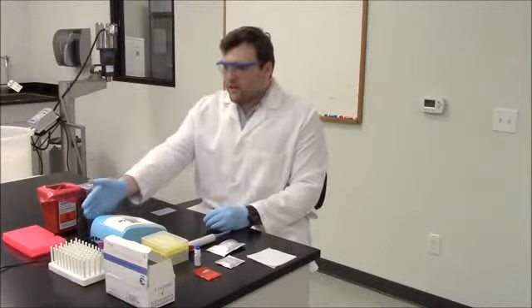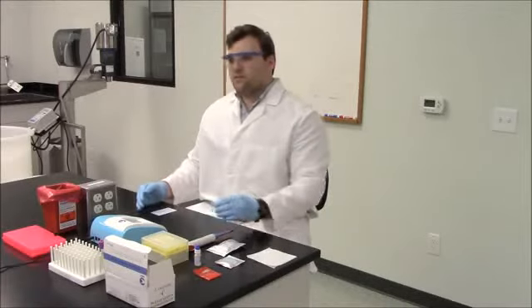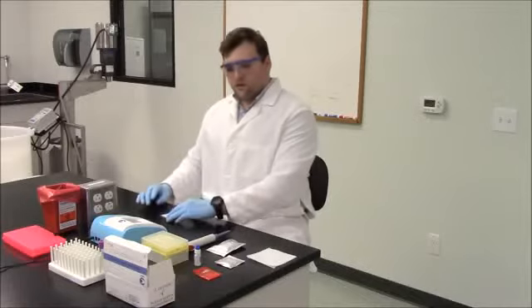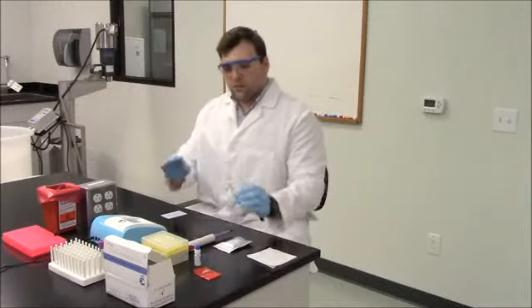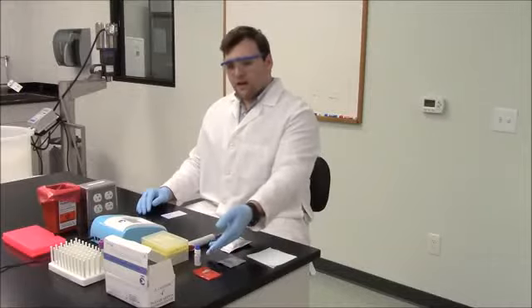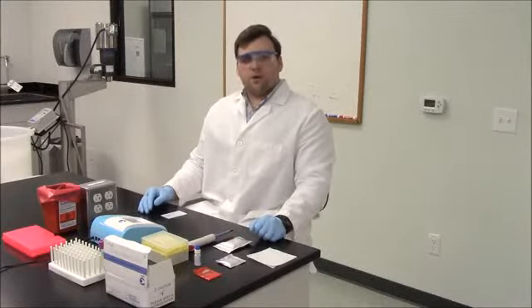The adapter connects to the analyzer. You will also need a pipetter and tips. Each reagent kit includes an NFC card, reagent 1, and test discs, all packaged in aluminum foil bags. The reagent kit also includes capillaries and a bottle of reagent 2. Before testing, all reagents should be brought to room temperature.